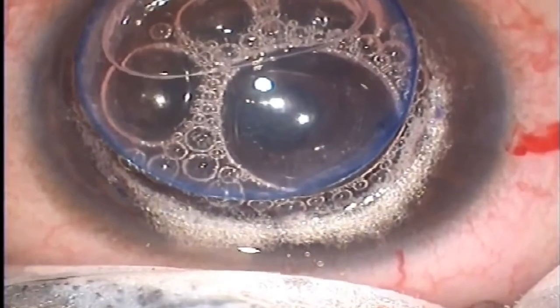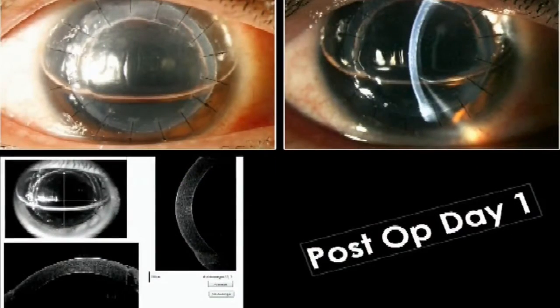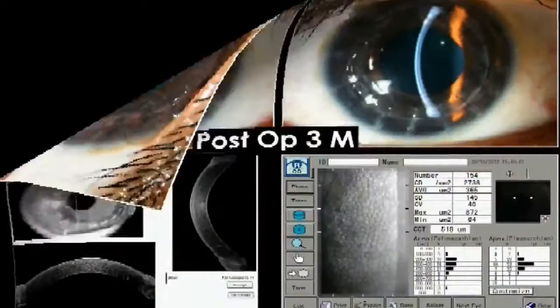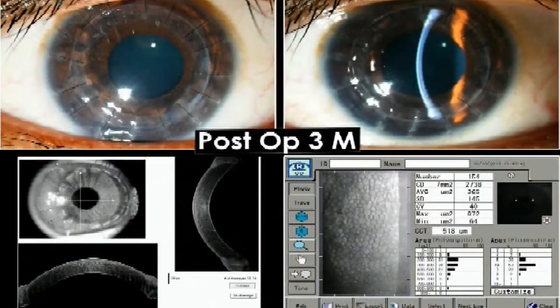Post-operative pictures with anterior segment OCT on day 1 showed good graft attachment. At 3 months, the patient regained a visual acuity of 20/30.